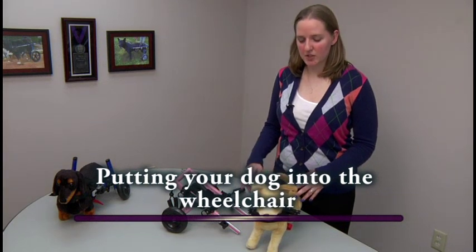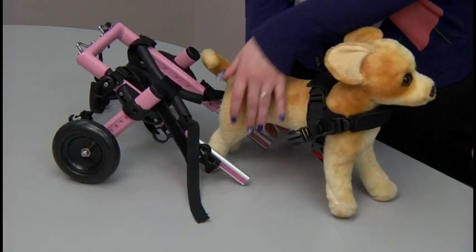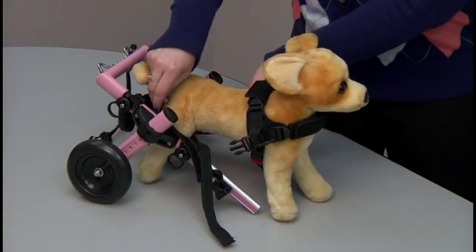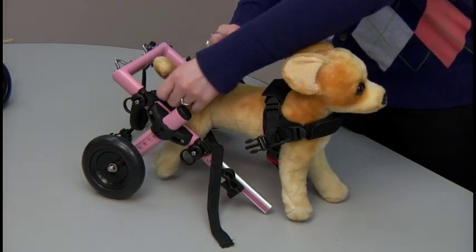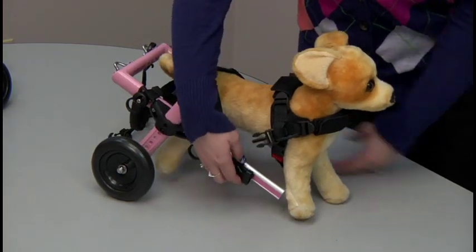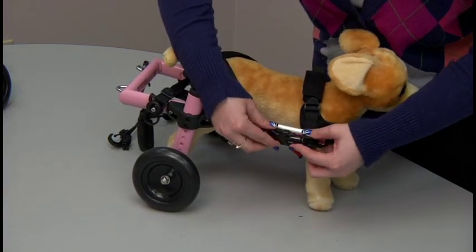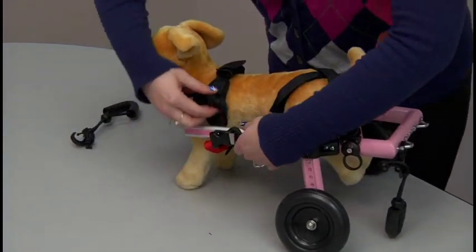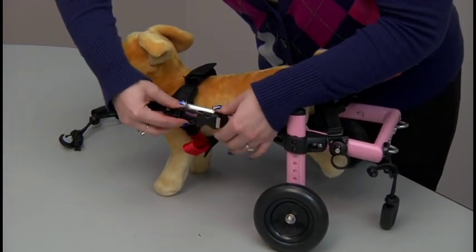Now we're going to show how to put the dog into the wheelchair. You have the front harness on and adjusted, and the leg rings are in the wheelchair. Grab the dog by the back legs and put the legs through the leg rings. If you're going to use the straps over the back, secure those over the dog's back end. Then lift the front of the cart, put the extenders through the loops of the front harness, and snap it in.